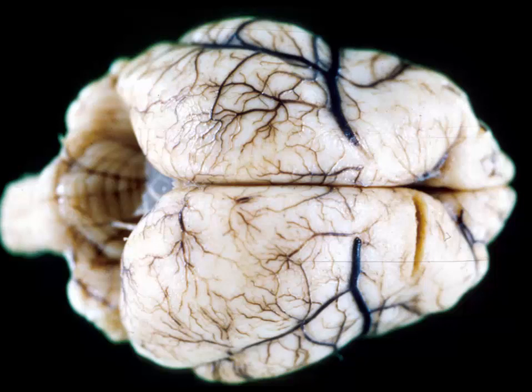The cortex is usually thicker on cut section, and the normal laminar arrangement is disrupted. And if you're really good at your neuroanatomy, and I'm going to confess I'm not all that great at it, and I always have to look up when I'm looking at sections of brain, I always go online and look on online atlases to make sure I know where I am. The normal arrangement of everything is really disrupted.